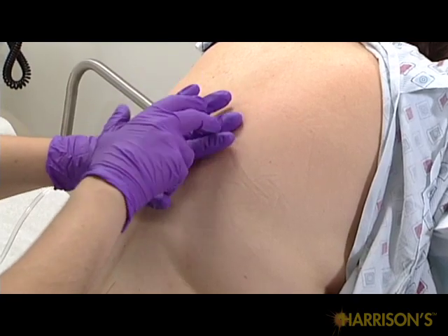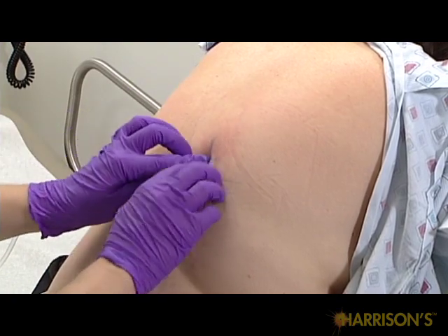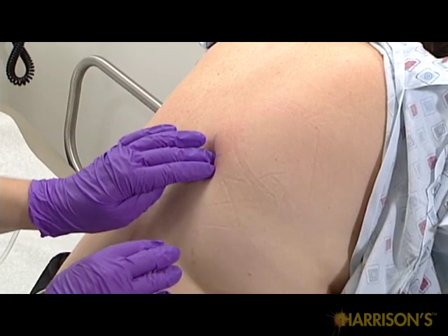Choose a spot 2 intercostal spaces beneath this level, 5 to 10 centimeters lateral to the spine, staying low in the costophrenic sulcus, but no lower than the 9th rib. Your puncture site should enter just above a rib to avoid intercostal vessel or nerve injury.